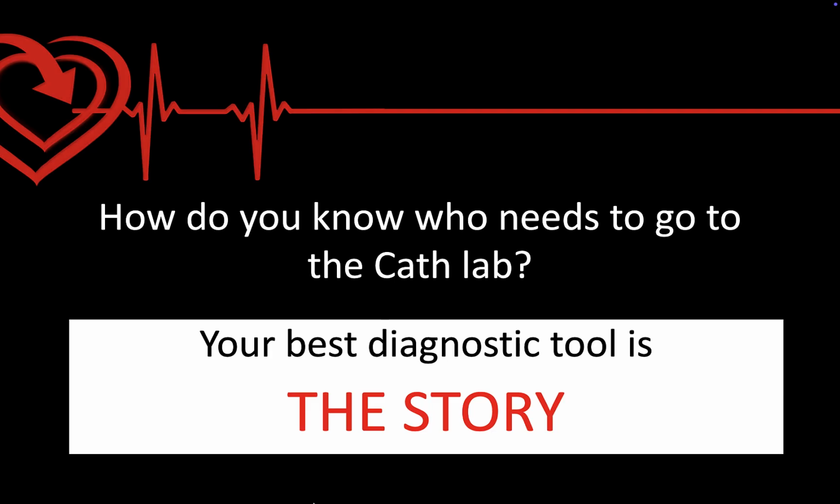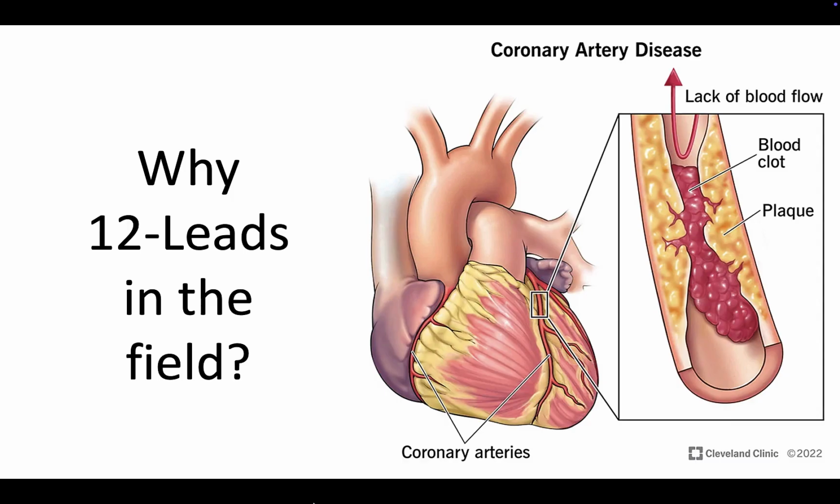We need to do comprehensive exams because those are the pieces of information that will help us make sure that we should be using the 12 lead to make a decision, as opposed to being lulled in or tricked into one of what I call imposters, those things that may look like a STEMI, but are actually being caused by something else.